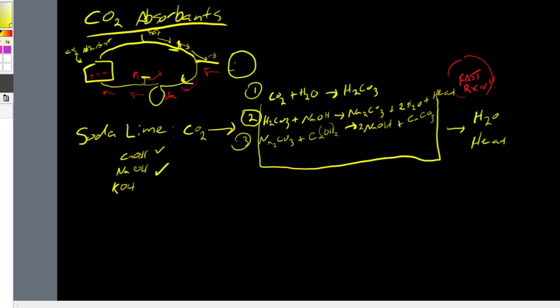So this reaction here is a slower reaction. So we're able to deplete less of our Sodalime stores. We're able to consume less quickly, as compared to if we just used this sodium hydroxide store here, or the sodium hydroxide as the main component of our Sodalime canister.